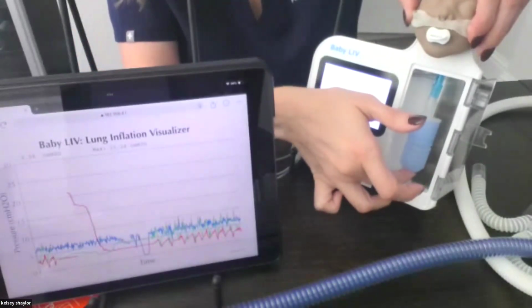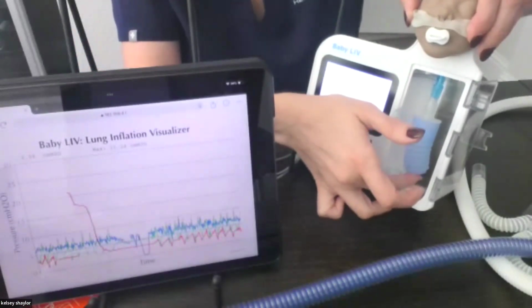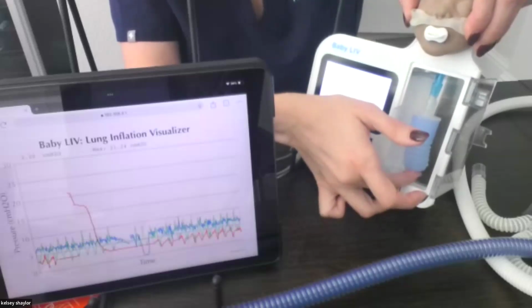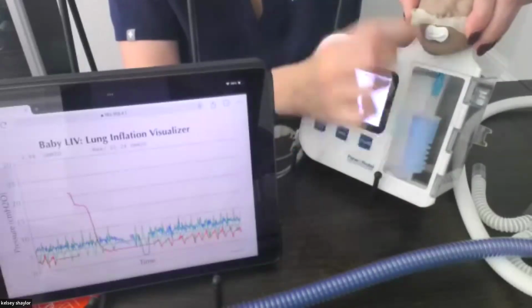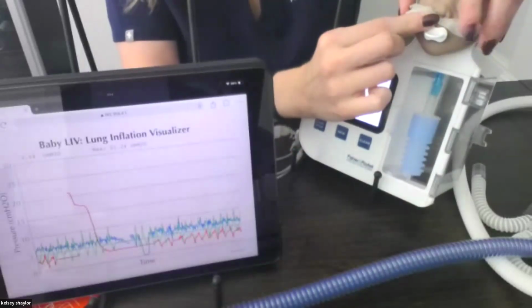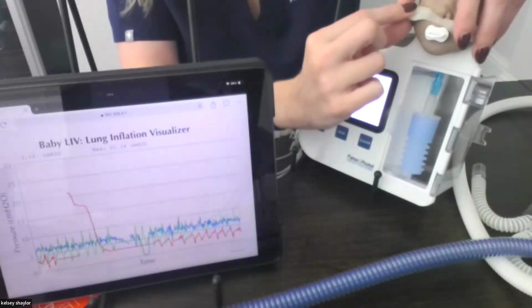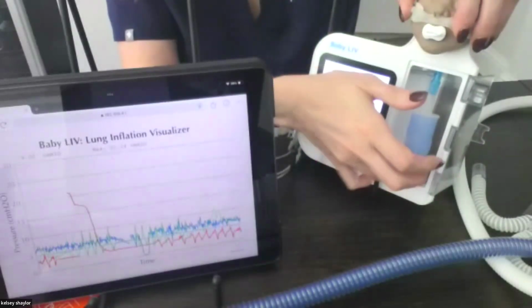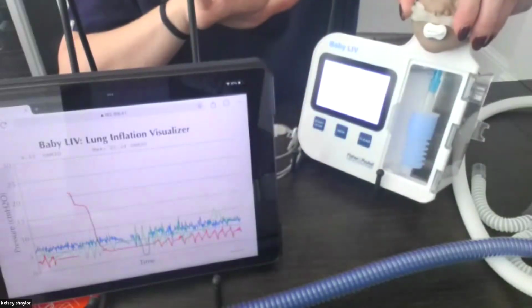But that just means that with that variability could mean those higher spikes of pressure. And again, it's going to be a lot harder for this baby to get rid of its CO2, to really exhale properly. And really that washout that we talk about so much with high flow is going to be a lot more difficult because they have to breathe around more of that prong. Depending on how high up in that nose we put the prong, again, we could see some really increased pressure. So that prong fit is really, really important, as well as using enough flow to truly get the effect of the therapy and support the baby.